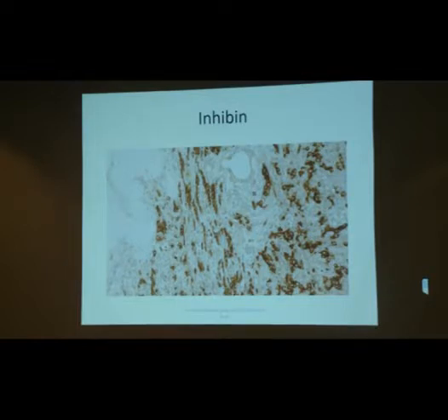So what does everyone think this is? Sex cord stromal tumor. I am a very bad person, can I just say, because I have only given you half the story. That's what I thought it would be.